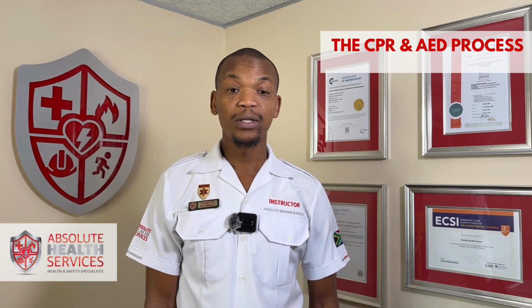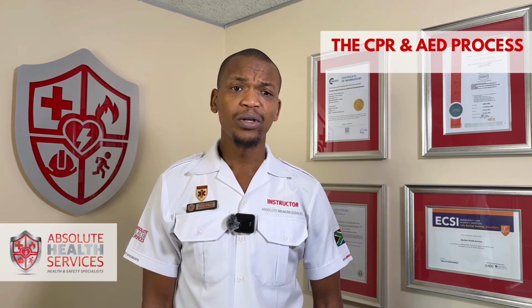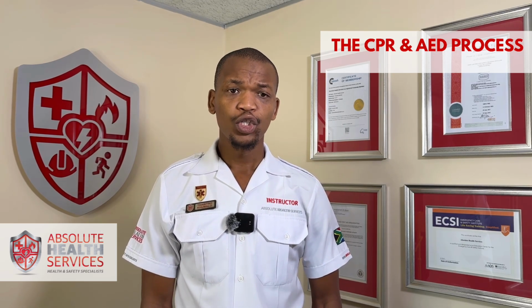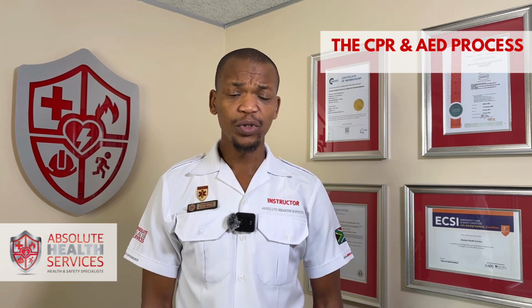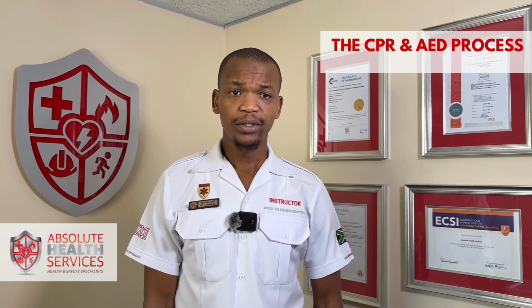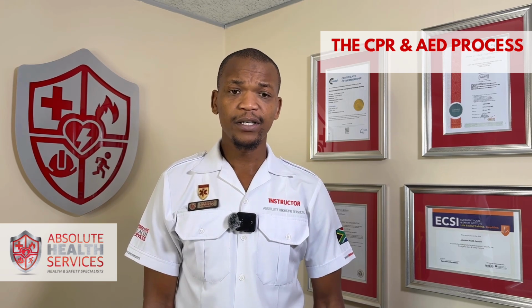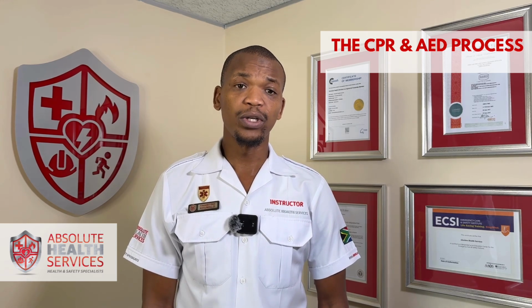One pad goes on the right hand side below the collarbone, and the other pad goes on the left hand side below the left breast. So you have the entry and you've got the exit. The right hand side pad delivers the shock to the heart, and the left hand side pad allows the shock to leave the system.